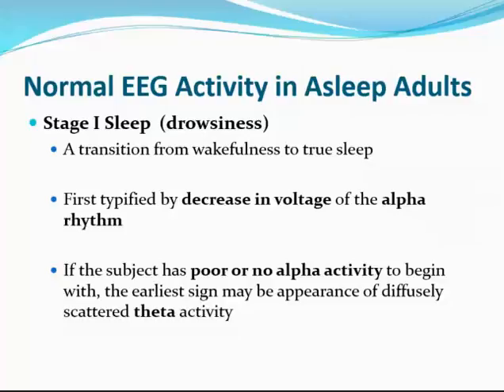Now, so far we've been talking about adults that are awake. Now let's look at the sleeping adults. In this case, we go into the stages of sleep. This is a subset of EEG called polysomnography, where you're studying sleep studies. There are actually sleep doctors here in America, and I know probably wherever you are, there are some sleep doctors as well, because sleep is a health issue.